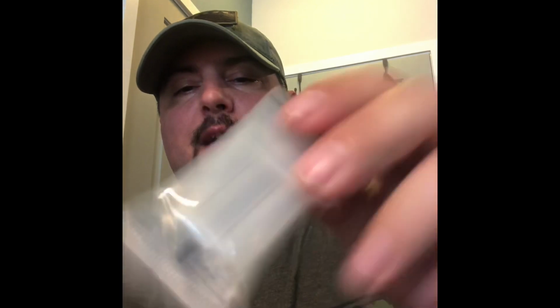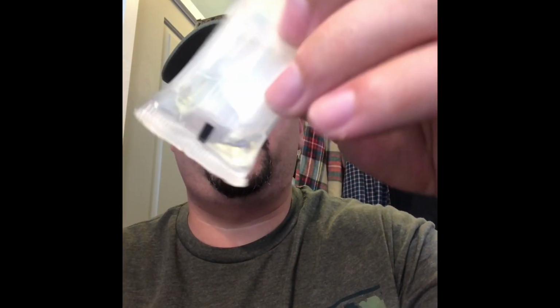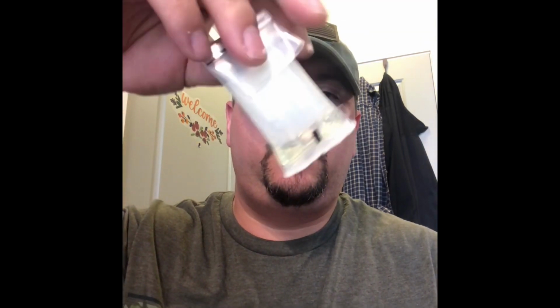It's never taken me 30 seconds to get that color whenever I've tested heroin or any other narcotic. So you can see the clear liquid in there moving from side to side. Still clear. Heroin's got to turn green, so whatever substance you put in there has to turn green for it to be a presumptive positive. And I break the third, and everything else mixes together. I've got nothing, still no color, it is clear. So not a false positive, not a positive, nothing. And that's heroin. I'm going to put that over here next to my mouse pad, and I'm going to save the other heroin for when I introduce a substance.